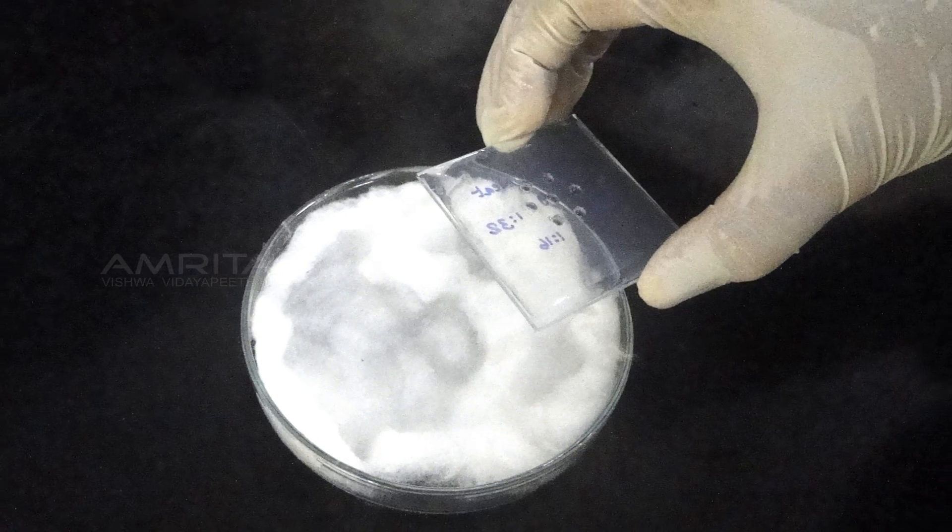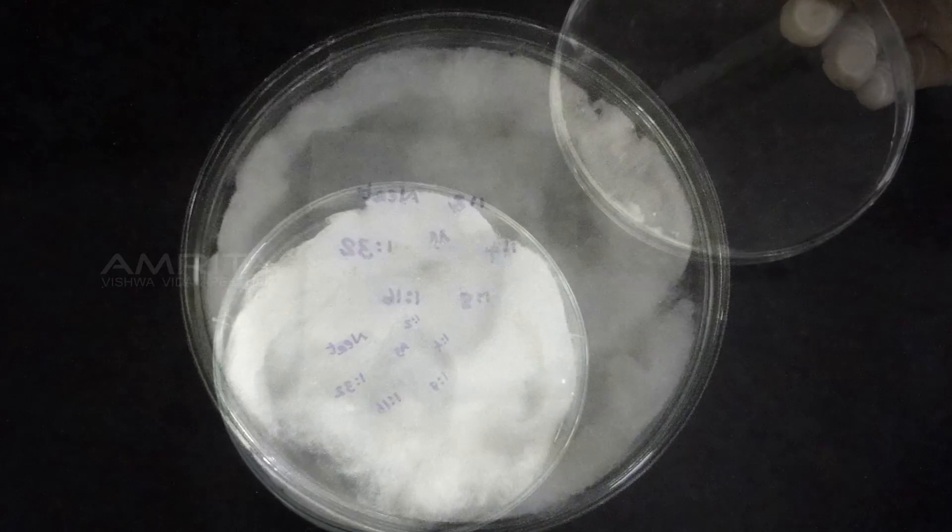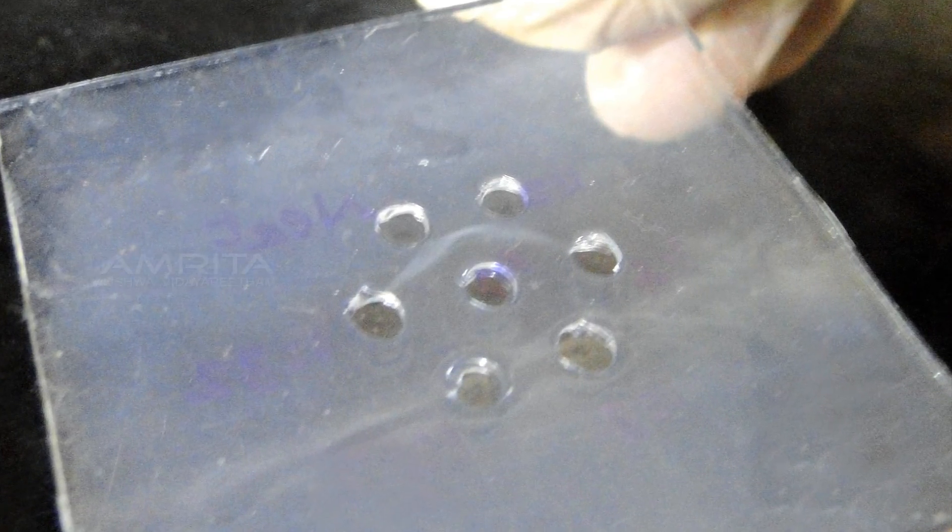Place the plate in a moist chamber and incubate at room temperature overnight. After incubation, observe for opaque precipitant lines between the antigen and antiserum wells.